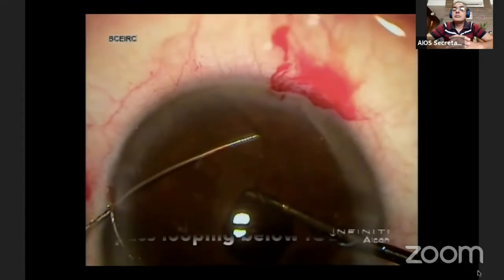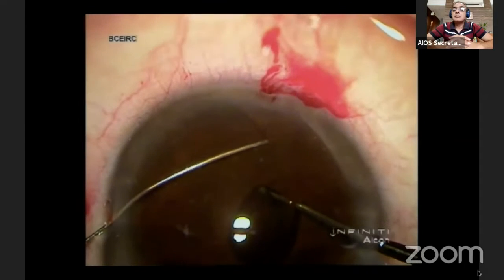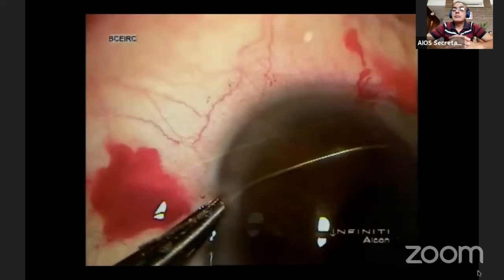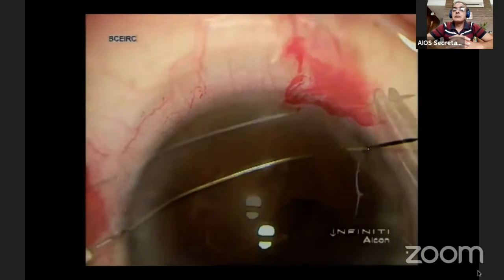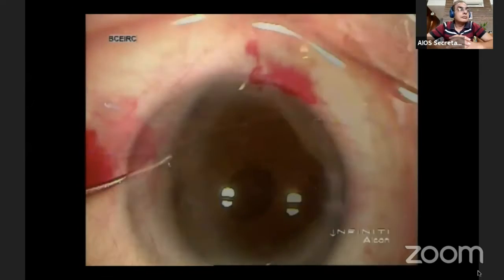A curved 10-0 prolene needle is passed through the iris, going below the haptic of the IOL, and it goes through the other side into the iris and out from the other side of the cornea.